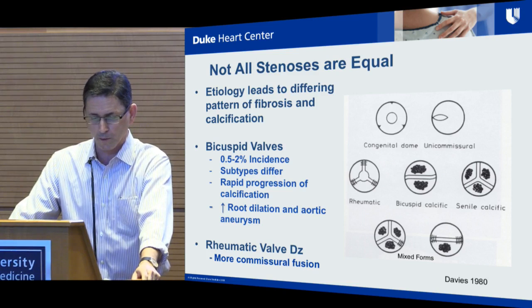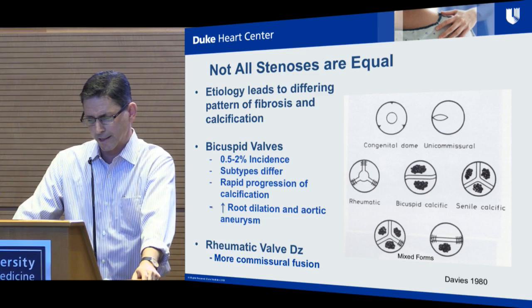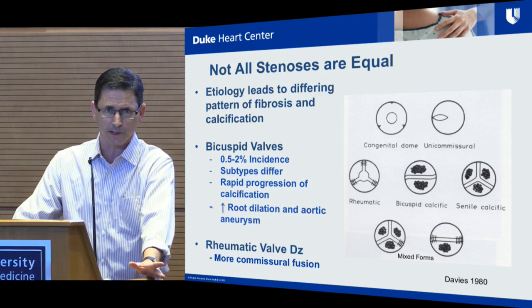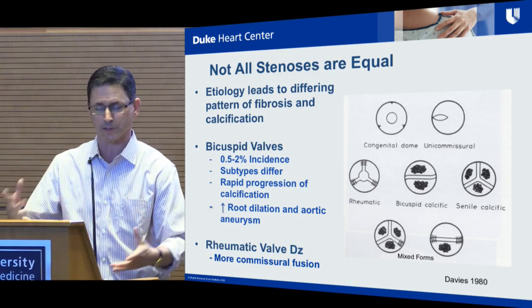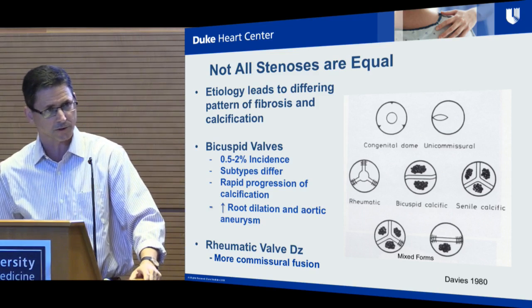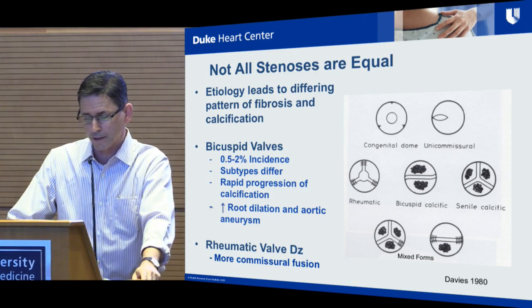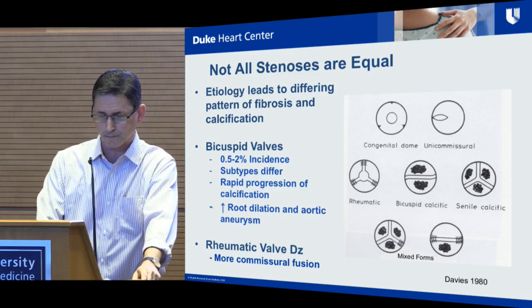So what we call bicuspid valves, depending on Sievers type and the degree of calcification, present a very wide spectrum of challenges for deploying a device across these valves, because they'll have different degrees of opening of the commissures, different degrees of non-compressible calcium, and then rheumatic valves are their own picture as well.